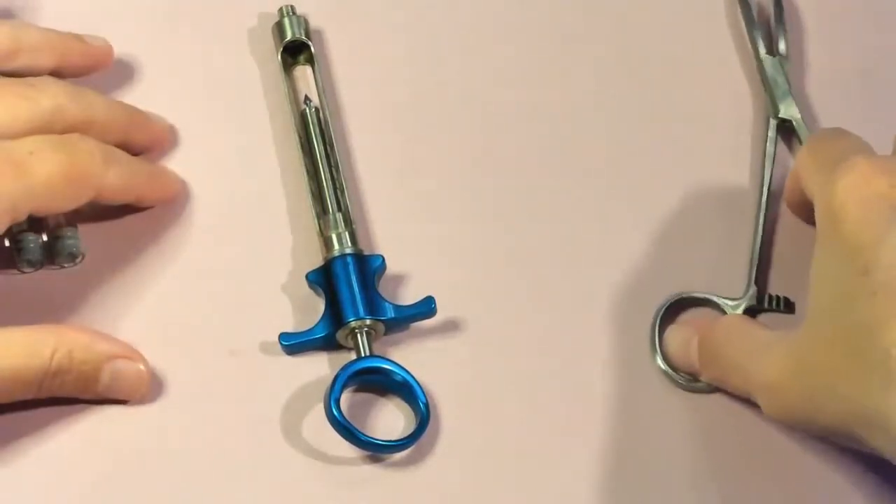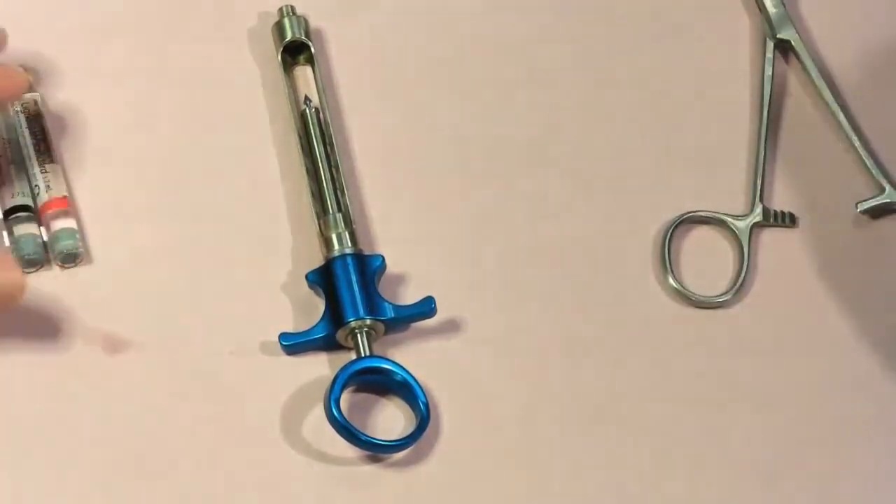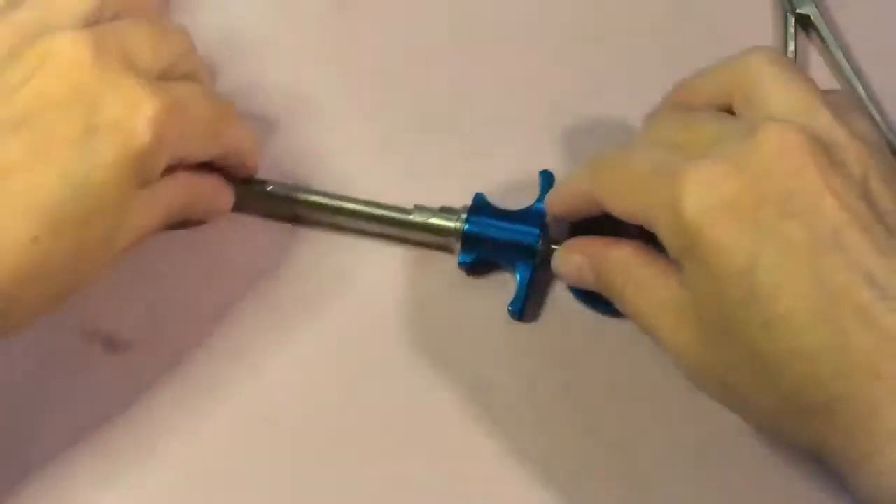Sometimes the rubber stopper from the dental cartridges will get stuck on the harpoon, and we can use our hemostat to safely remove that rubber stopper. We never want to use our fingers to remove a rubber stopper, as that could be a potential stick and risk for contracting some type of illness with blood-borne pathogens. So we keep the hemostat out, open, and available on our tray.